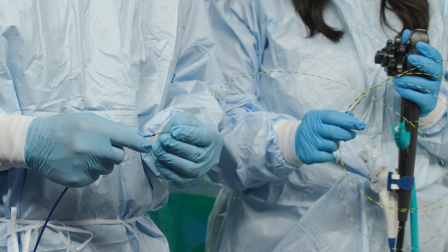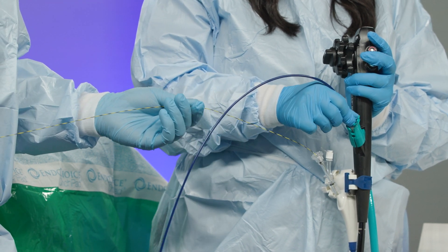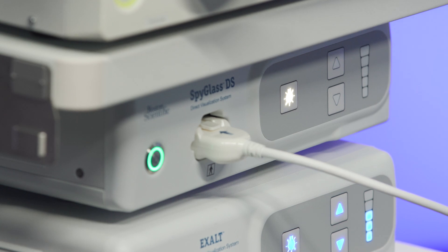Load the SPI Scope onto the back of the guidewire. When the wire exits the working channel of the SPI Scope, provide back tension. Turn the light back on.